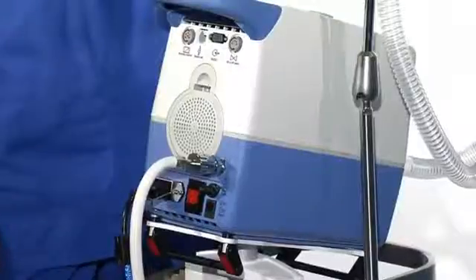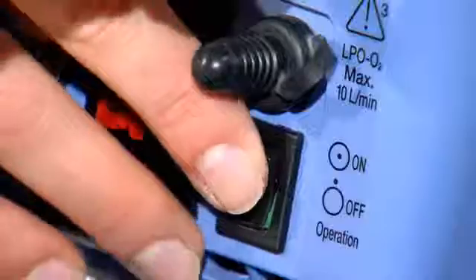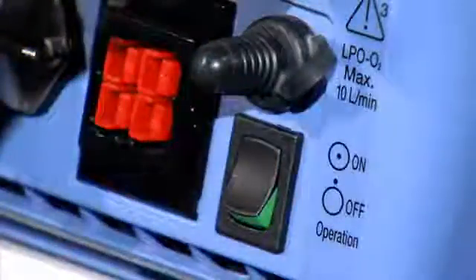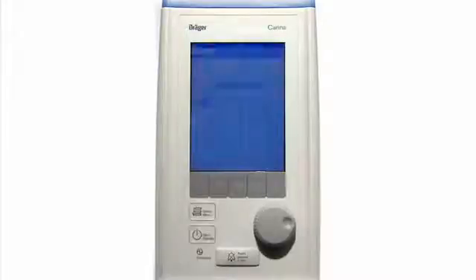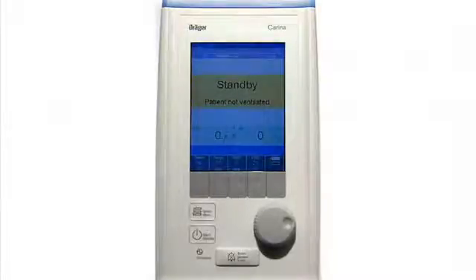To switch Carina on, please push the power switch on the back of the device. When starting up, an alarm will sound briefly and the LEDs will light up. After Carina performs a short internal self-test, the device proceeds to standby mode.